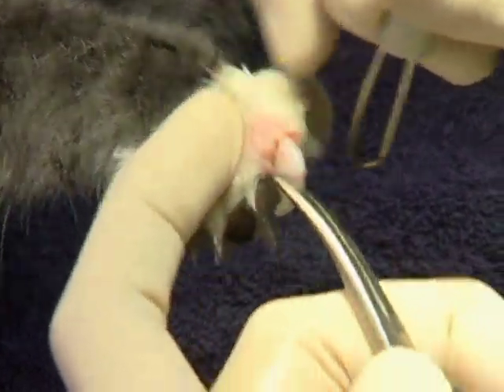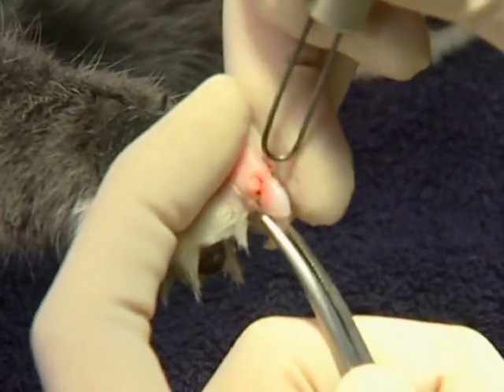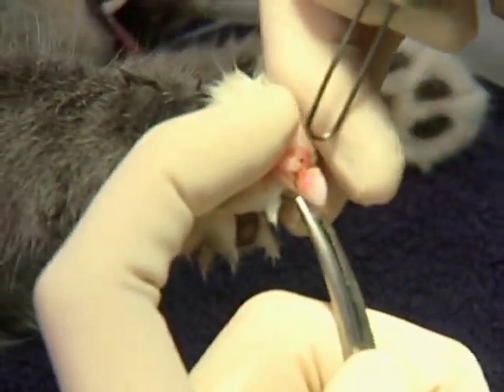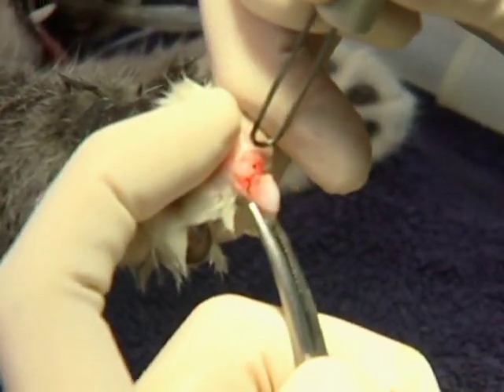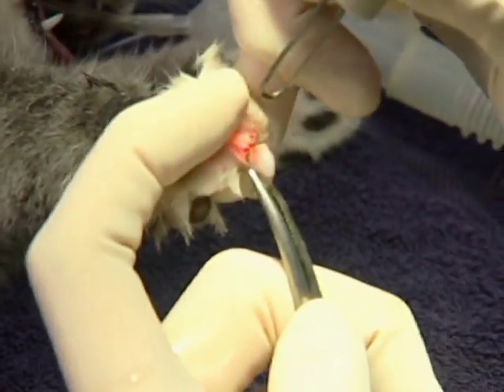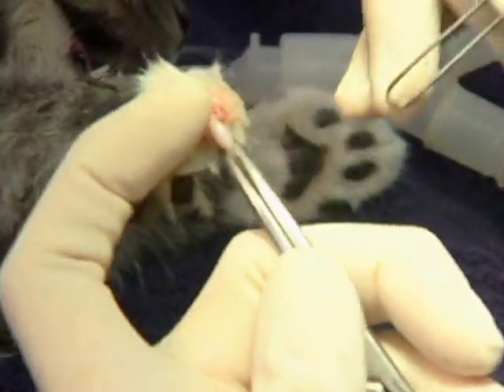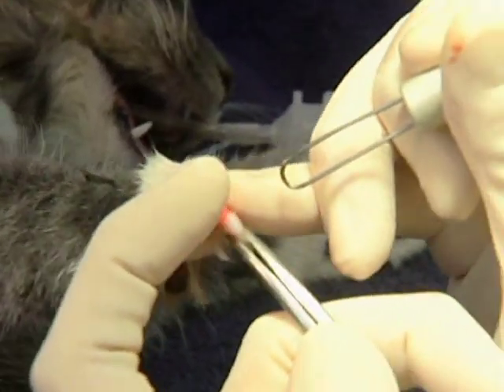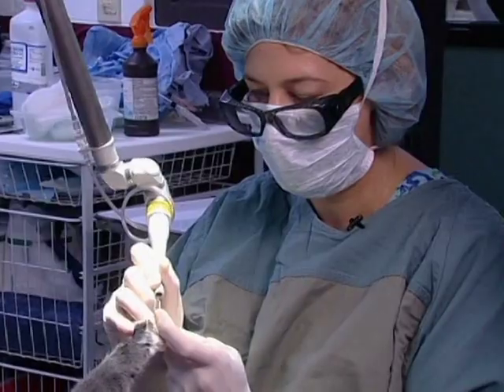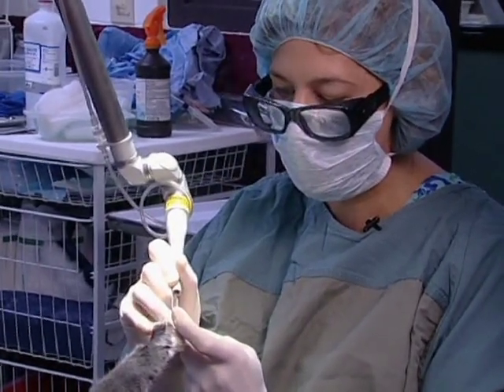As you get better, you can turn the claw upright as you come along. That actually was just getting through the skin, but I did hit all the way through and open up the joint with that first incision, being this is a small patch. That's actually opened up the joint and cleaned it up. Next are the collateral ligaments. They run top to bottom, P2 to P3. As you cut them, you'll see P2 sink away.